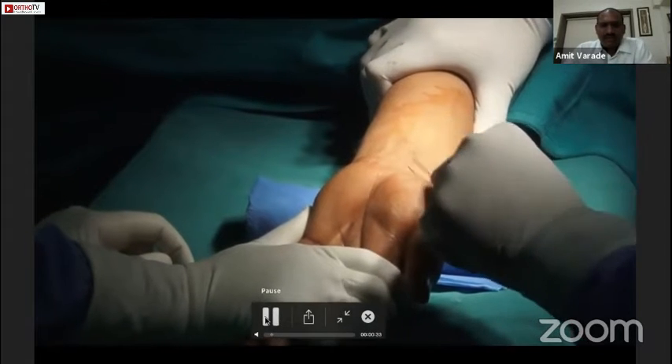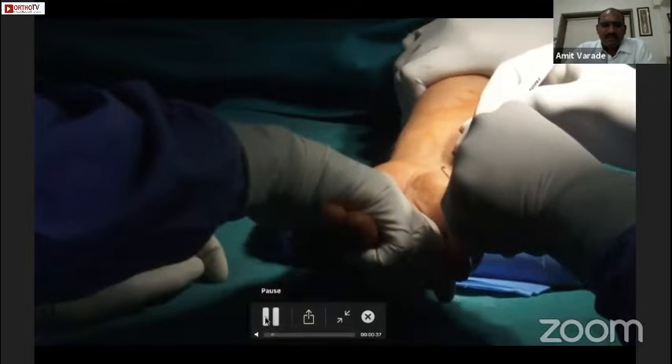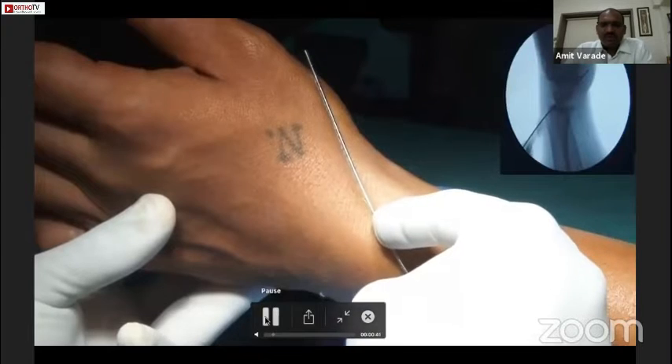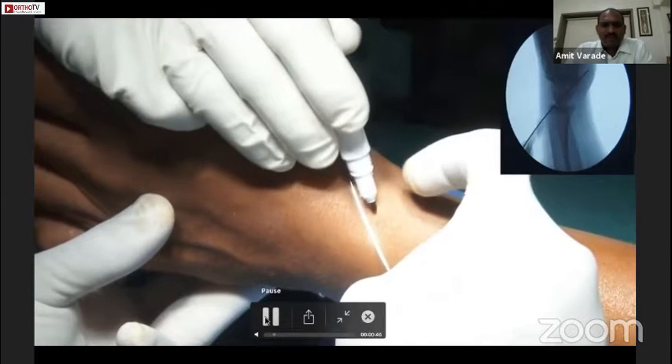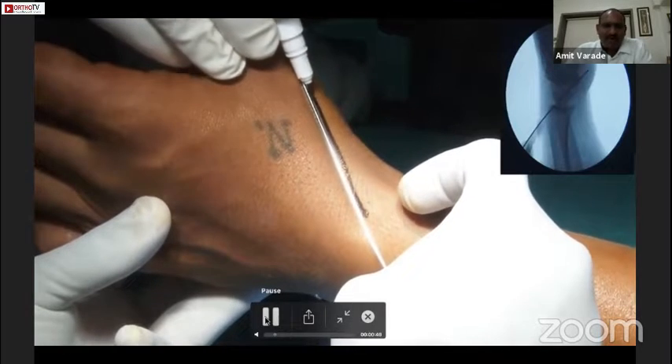Next we mark on AP and lateral planes, and we confirm this under the C-arm. This gives us an idea for putting the guide wire in the scaphoid.